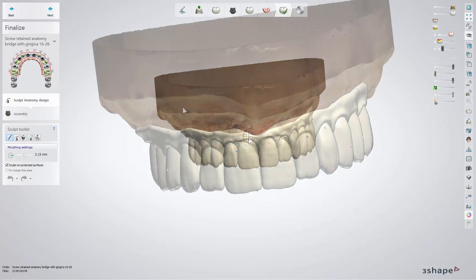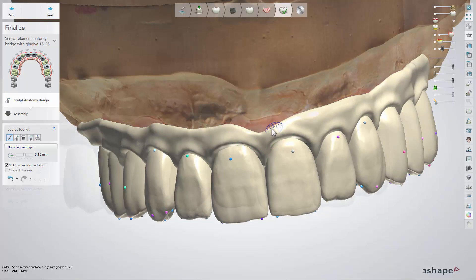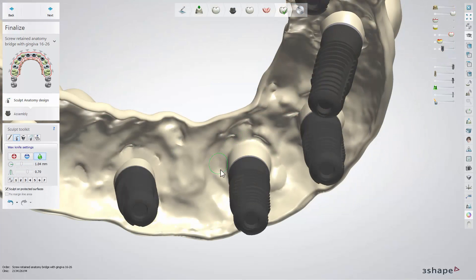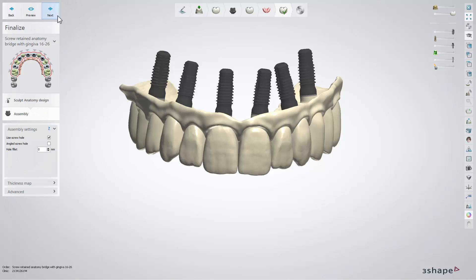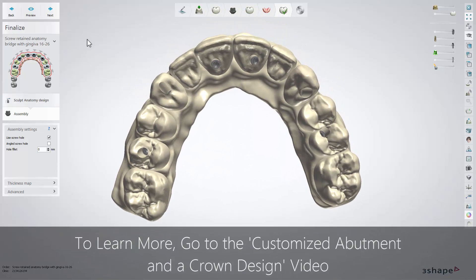At the Finalize step, the teeth and Gingiva are combined. It gives you the chance to make adjustments to the whole design at the same time. Use the Sculpt toolkit tools to do that. Once the modification of your design is finished, go to the Assembly step by clicking next, where the bridge and abutments will be combined and screw holes will be created.